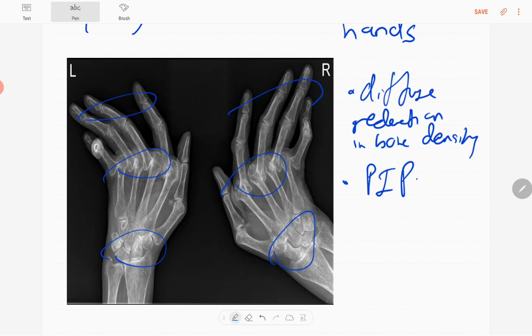The distal interphalangeal joints are relatively preserved. There is also soft tissue swelling visible. There are multiple dislocations of the second to fifth metacarpophalangeal joints, and at the wrist or radiocarpal joint you can see reduced joint space with irregularity and erosions.